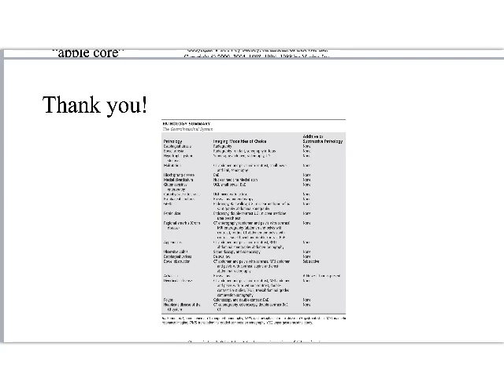Okay, last thing here is just being able to look at these things, and this slide is terrible, but the thing to circle right here is bowel obstruction subtractive. Bowel obstruction subtractive, and you are good to go.